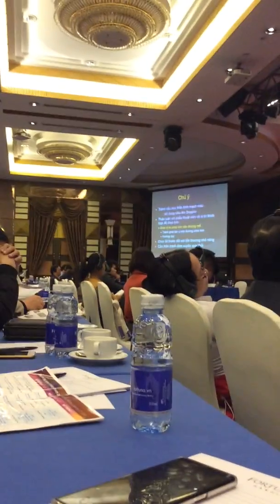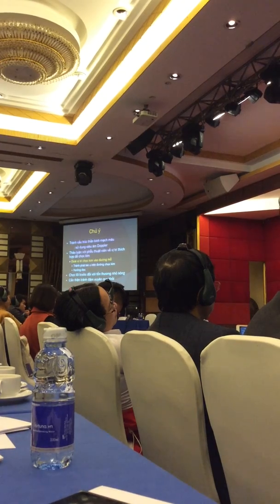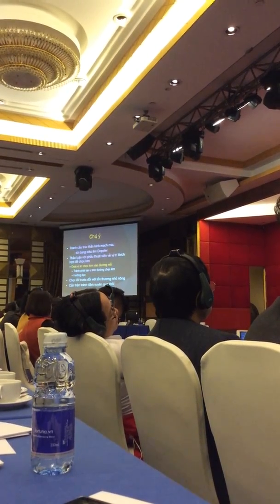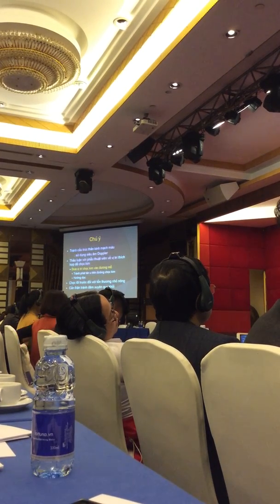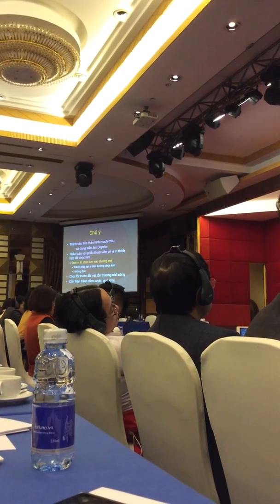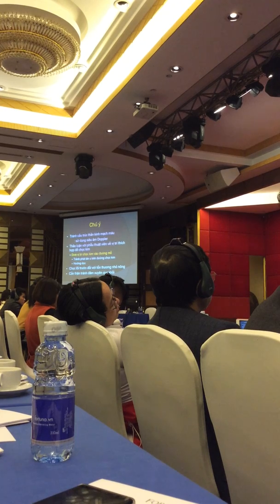I don't know if this is understandable to you. I think unless you have had experience with biopsy, this may be hard to understand. Be careful not to pass the mass, as this may cause contamination of the deeper structures or hit deeper vital structures.